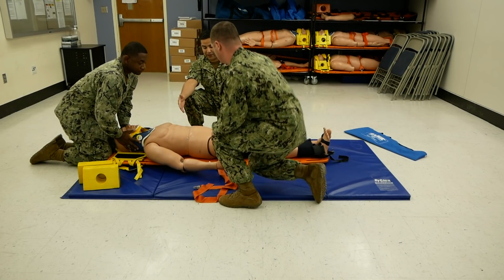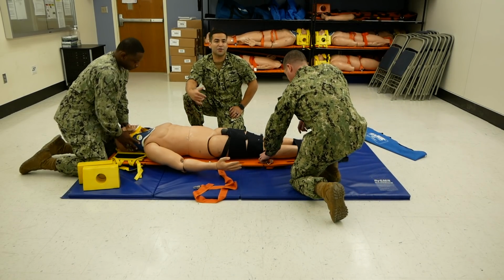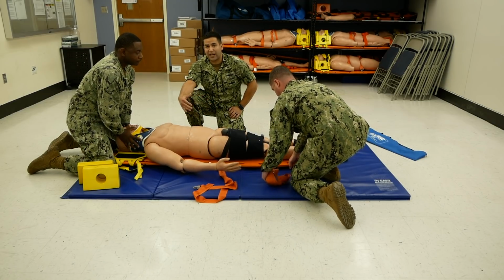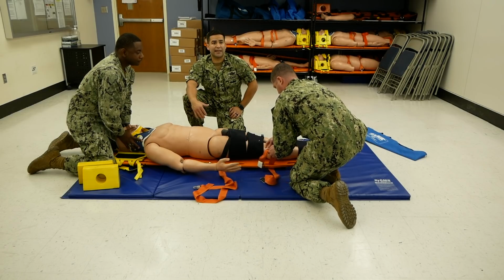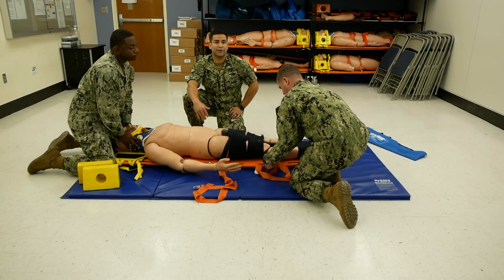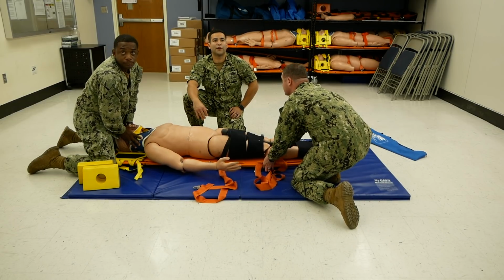Now that we have the patient on the spine board, we want to go ahead and use this opportunity since we moved the patient to reassess the interventions, to check the vitals, and repeat primary and secondary assessments, and gather your field impression.